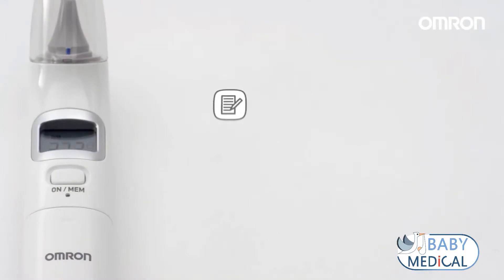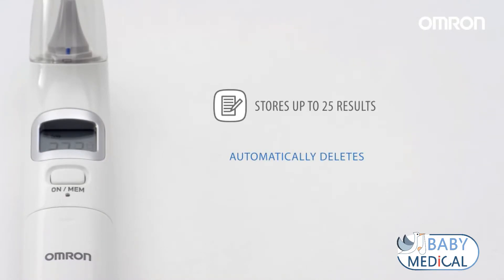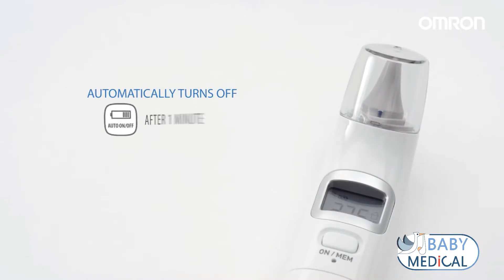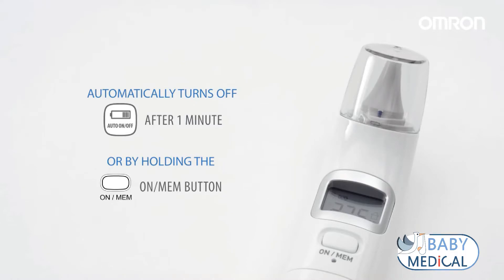This unit automatically stores up to 25 results. If the memory is full, the unit will delete the oldest reading. It will automatically turn off after one minute, or by holding the ON MEM button until OFF appears.